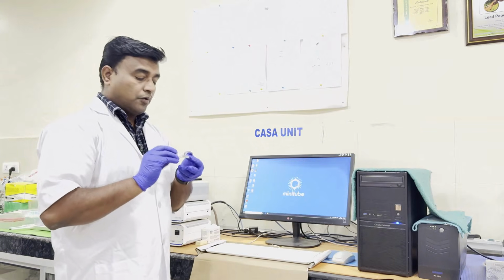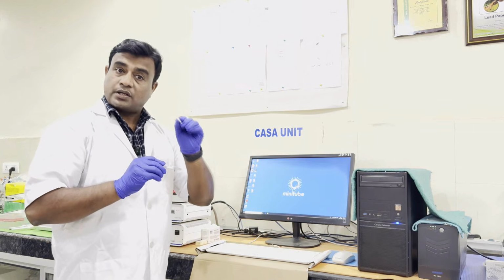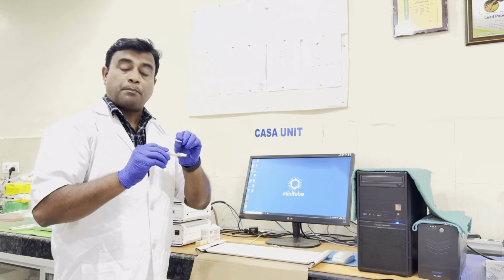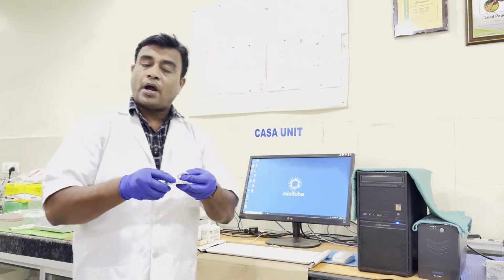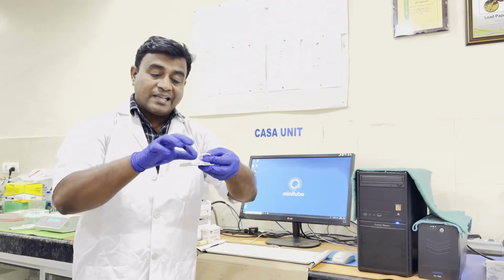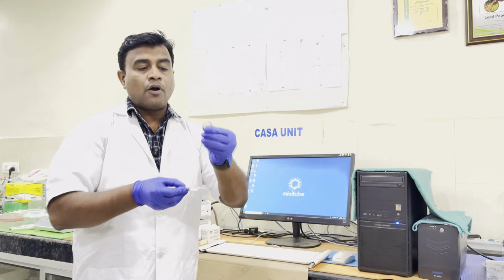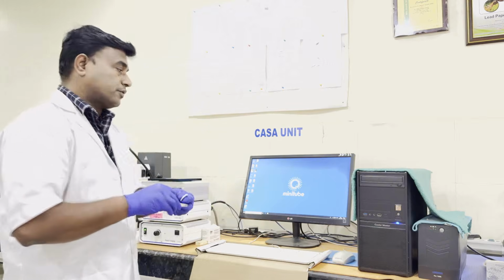This is one where we use 3 microliters of semen, which we upload, and then we put the cover slip, which is a thicker glass cover slip. It is around 5 mm in thickness, so that it will cause a pressing effect on the drop of semen and cause uniform distribution. It has a 10 mm disc-shaped area, which is known as the platform. On the platform, with this cover slip, the semen distributes uniformly.